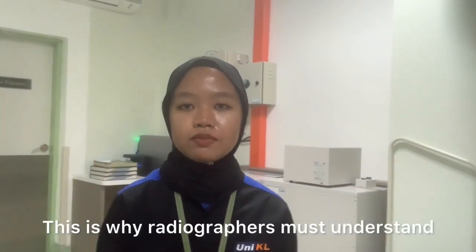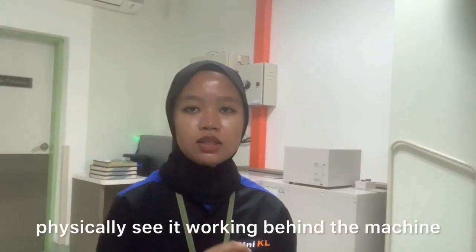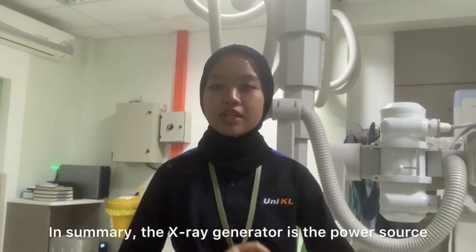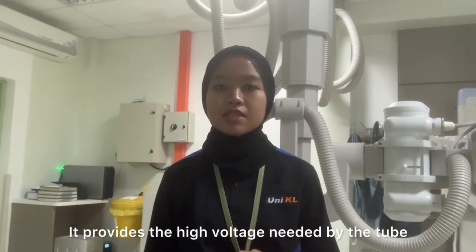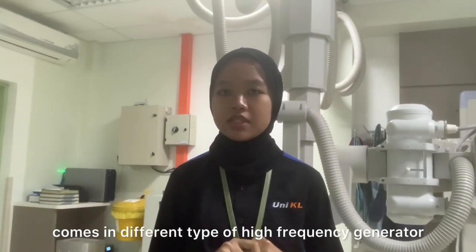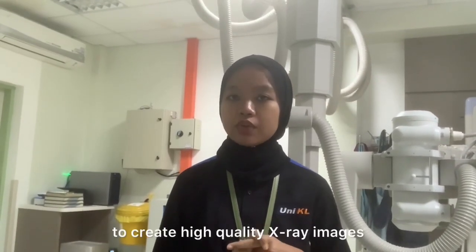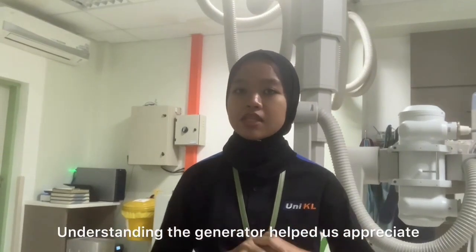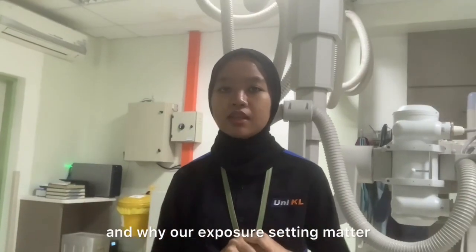This is why radiographers must understand what the generator does, even though we don't physically see it working behind the machine. In summary, the X-ray generator is the power source that drives the entire imaging process. It provides the high voltage needed by the tube, comes in different types such as the high frequency generator, and works together with exposure settings such as KVP to create high quality X-ray images. Understanding the generator helps us appreciate how the machine produces radiation and why our exposure settings matter.